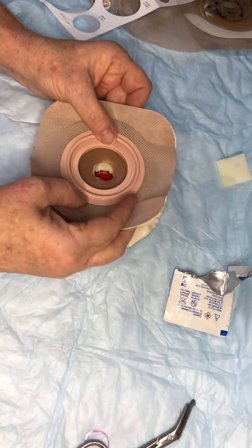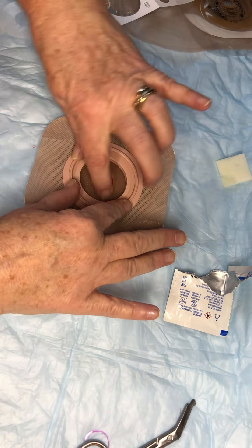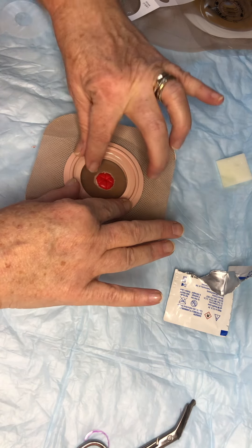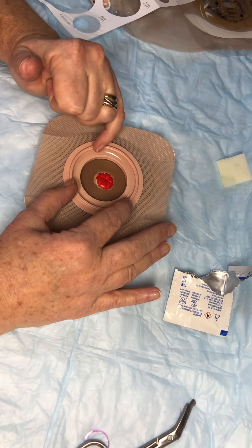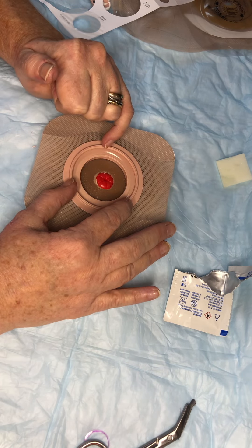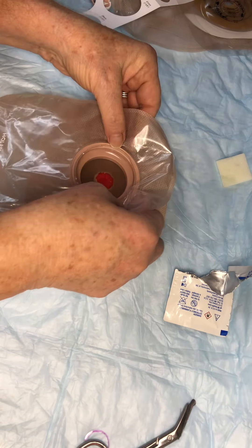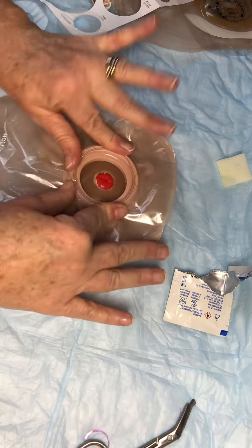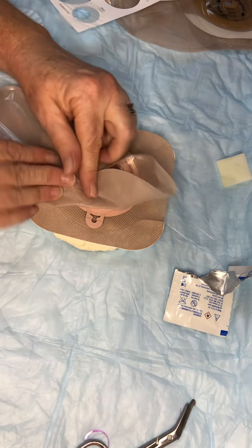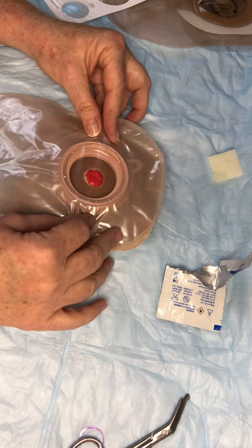You can even kind of pinch it around the edges. Then you're just going to place it so the stoma is exposed - push it down and give it a good patting down all the way around. You want your stoma to be exposed, but all that extra skin that's irritated and red and weepy, you want to get that completely covered. Slap your pouch on, and then I would put a belt on right away, which just hooks up onto these little hooks here - and there you go.